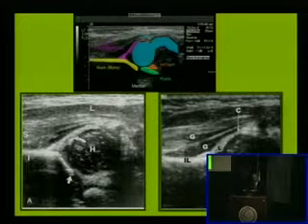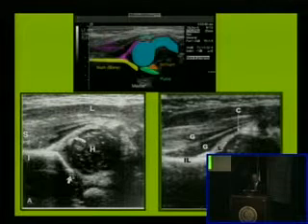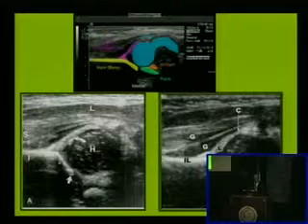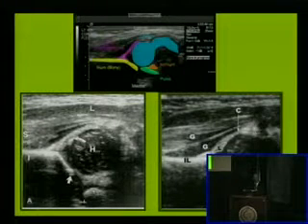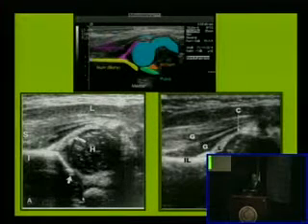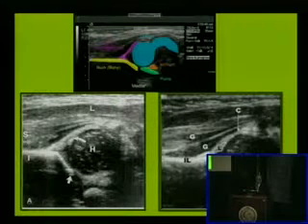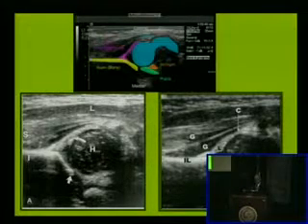The ilium, which is straight, parallel to the surface of the transducer, the acetabular floor with the area of junction with the triradiate cartilage, the echogenic acetabular roof with the echogenic labrum shown in the same plane, and lastly, in my opinion, this is very important, this like an angry mouse, this represents like an iceberg, as you like. This is the pubic bone and should be present in the same plane as all these structures. The femoral head, acetabular floor. Some authors describe a ball in a spoon. This is like a spoon, and this is like a ping pong ball inside the curvature of the spoon.